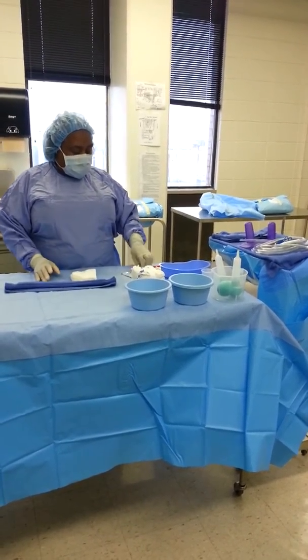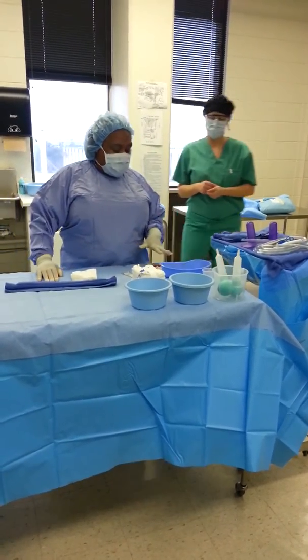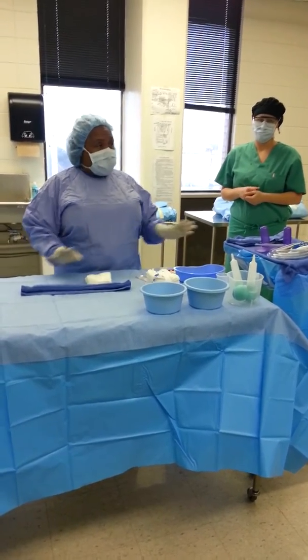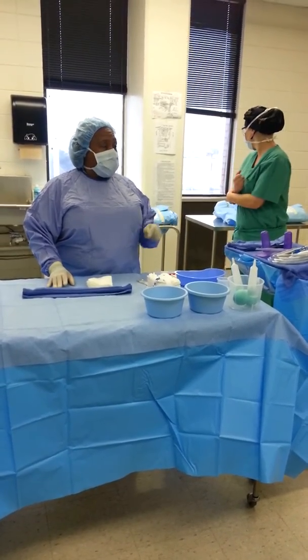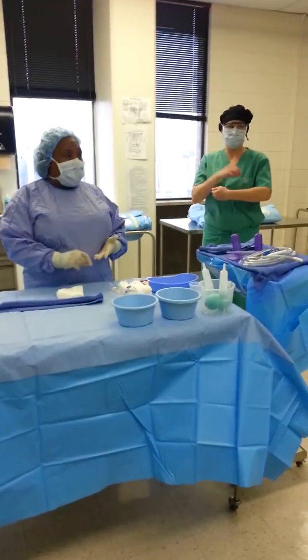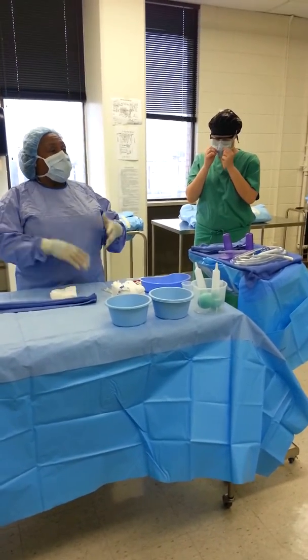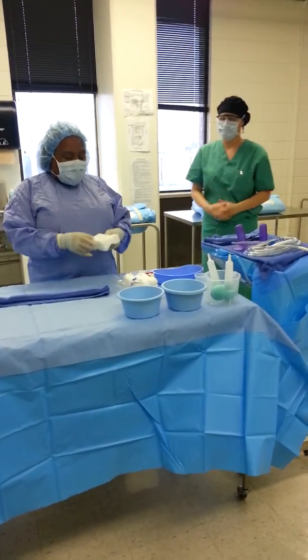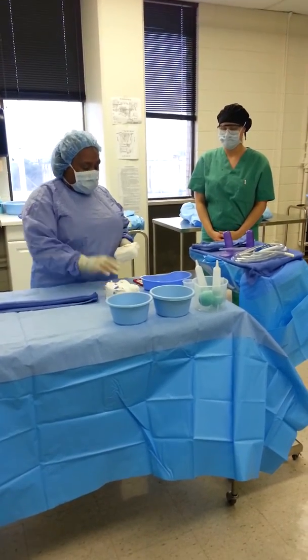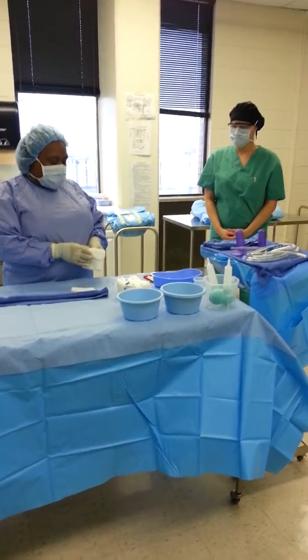If I'm going too slow, she'll ask me, because she's paying more attention to the time than I am. Are you ready to count? And I'll say yes. It doesn't matter where you start. It's up to you. You just need to make sure that you count everything. She will have a piece of paper with the items listed, so she can call them out to you and you count, or you can just start counting and go from there. Do not take the wrappers off items until you're ready to count. Okay, Raytex sponges. You always pull at the fold.